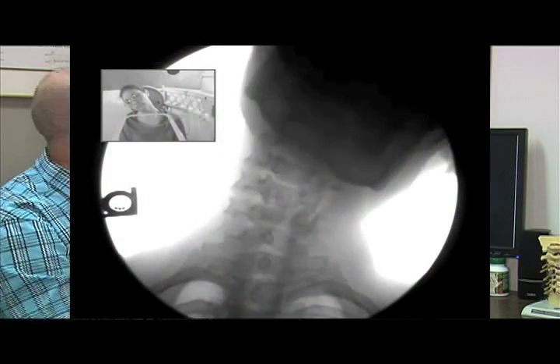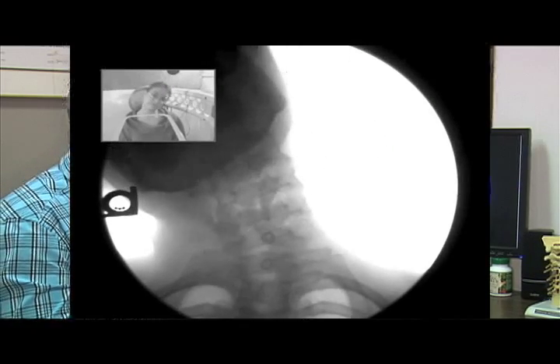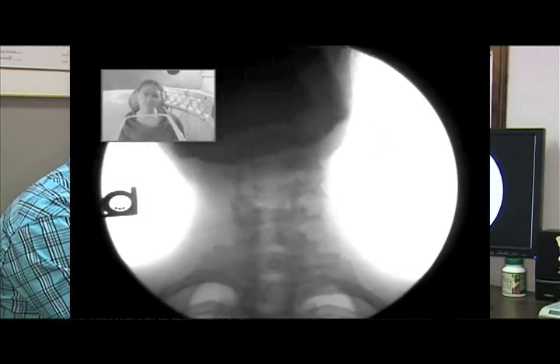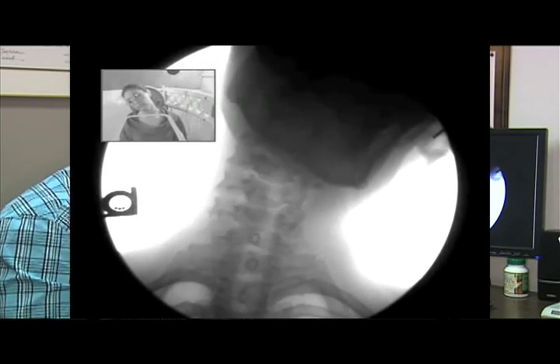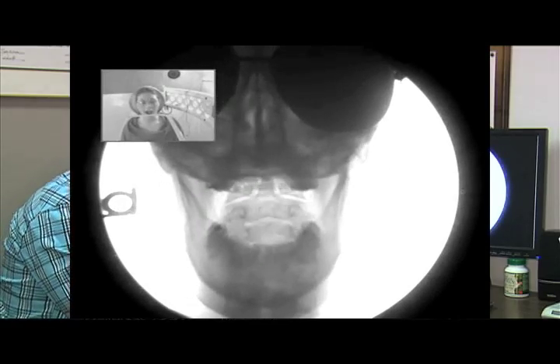So to understand where your X-rays are, if we take X-rays of you, the best is to see what a normal looks like and then compare to the normal. I think it's like Sesame Street. One of these things doesn't belong here. Can you guess which one? If a person is shown what the normal looks like and you show what's not normal in their X-ray, they're smart enough to see the difference, and a lot of people appreciate that knowledge.